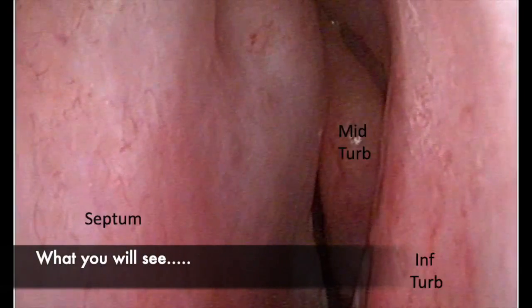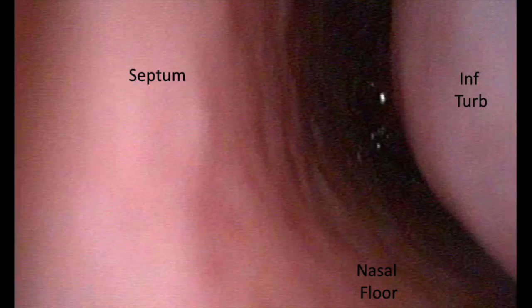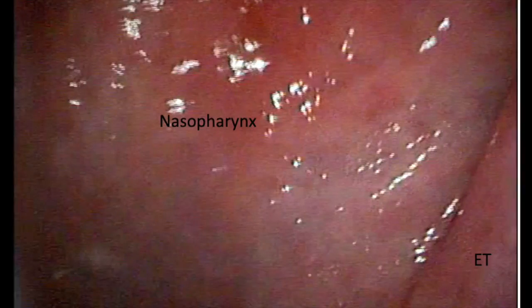Here is a video of what you will see. First you see the inferior turbinate, middle turbinate, and septum. Aim towards the floor of the nose and advance forward. You will look to see the septum medially and the turbinate laterally.